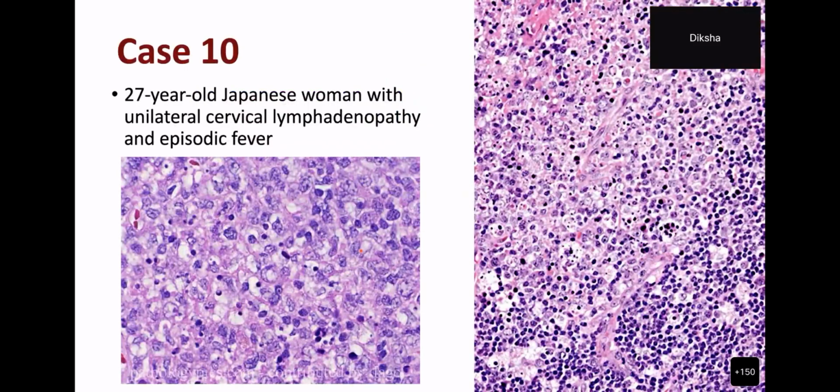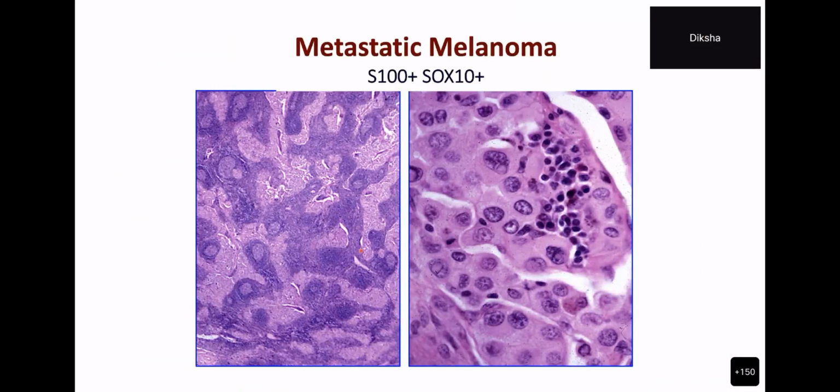Yes, ma'am, there's one. Can you diagnose LCH in a case of sole lymphoid lesion without any bony lesions and skin lesions in an adult female? You can. I did take out some slides, and I actually have a picture of LCH in a lymph node next to RDD. The two of them can occur together, but that's not the question. The question is, can you make that diagnosis if you see no lytic lesions and only one place? And the answer is yes, you can. It is probably less common.